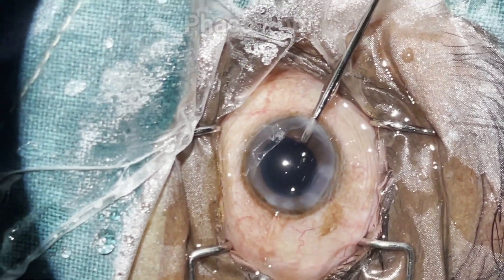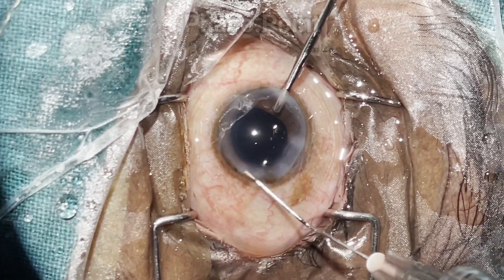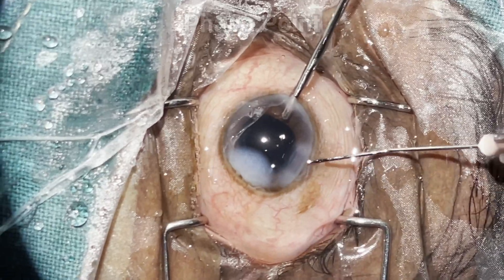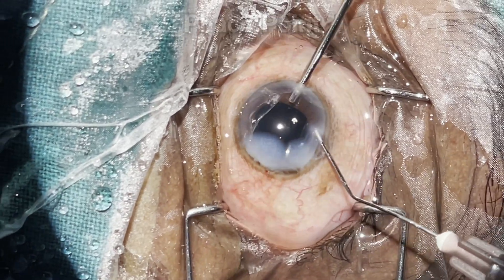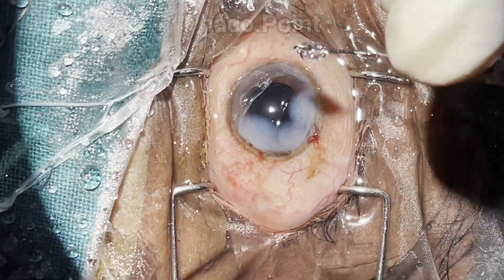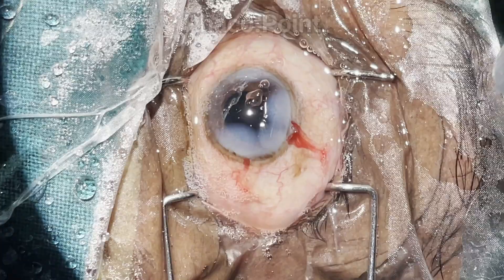The aspiration cannula is withdrawn, and the side port followed by the main port are then hydrated. Finally, the irrigation cannula is removed from the eye and the second side port is also hydrated.